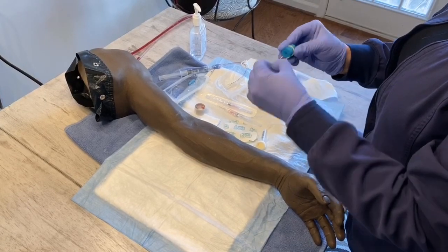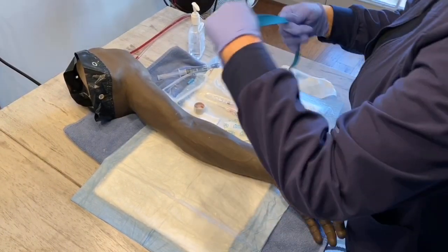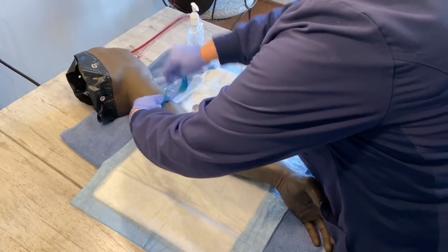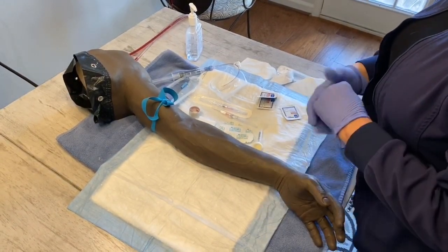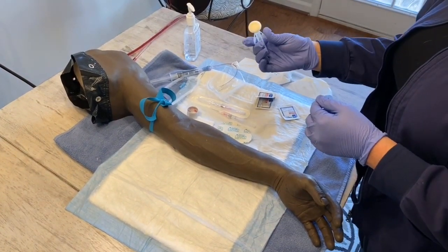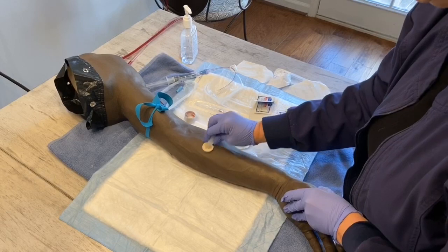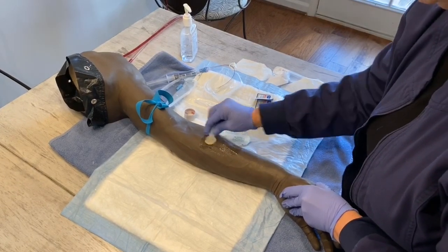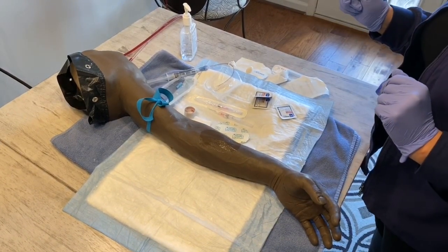So now I'm going to go ahead and apply my tourniquet. And then I have already identified the vein that I'm going to stick. So now I'm going to want to cleanse it with an aseptic solution. This is a chlorhexidine prep. Always make sure that you pop it. And then you're going to want to do a back and forth scrubbing motion on the vein that you want to stick in the area that you're going to insert your catheter in. Always let it dry. Do not blow, do not fan.